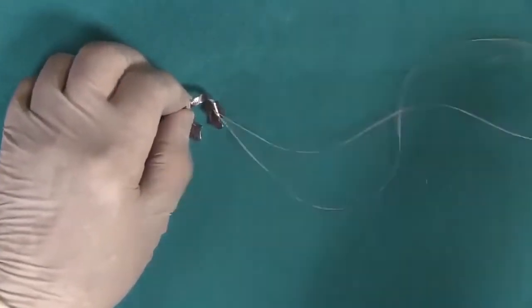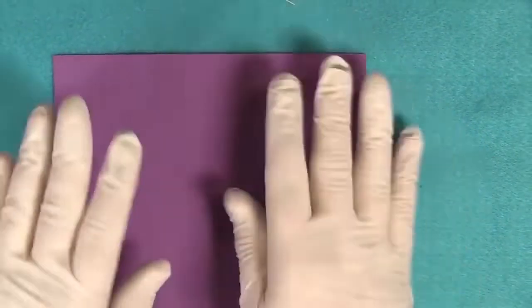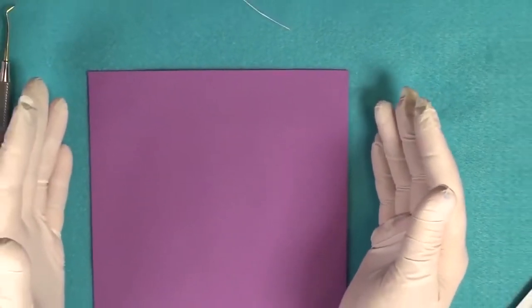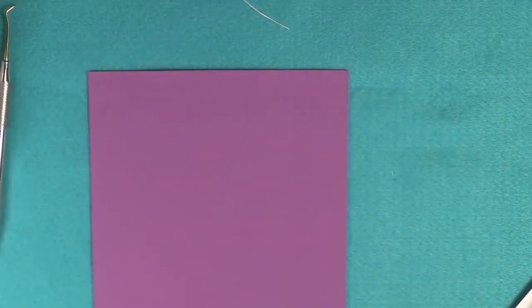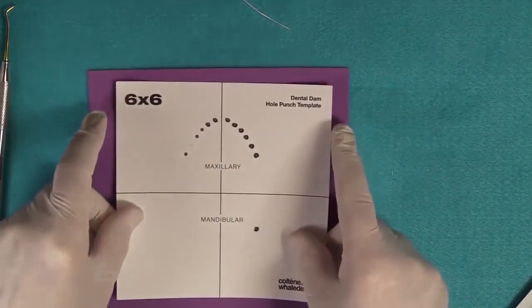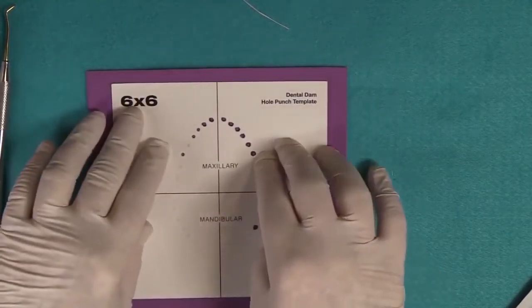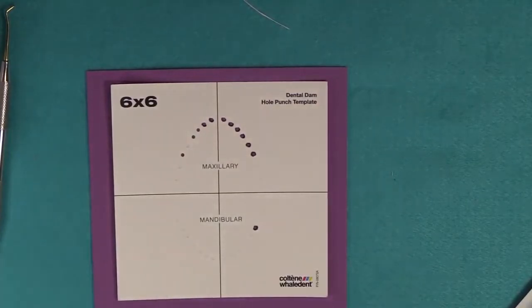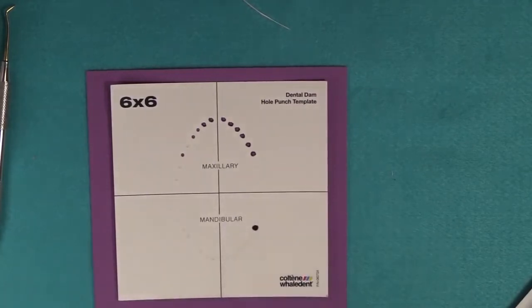Okay, so that being done, the next step is we're going to take our piece of dental dam, and some of you might need some assistance as to where to place your holes. Of course, I have applied dam for many, many years. I pretty much can visualize where I want to put my holes. However, there is a template that you can use, and by the way, we're using a non-latex dental dam, and the template that comes in the box, you can simply perforate the holes and mark with a felt tip pen.